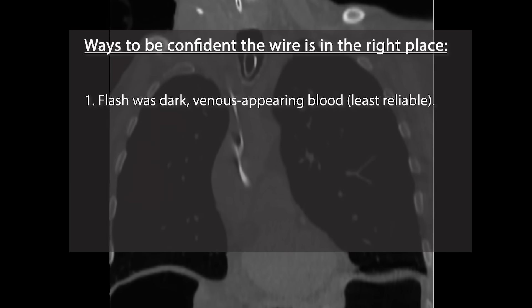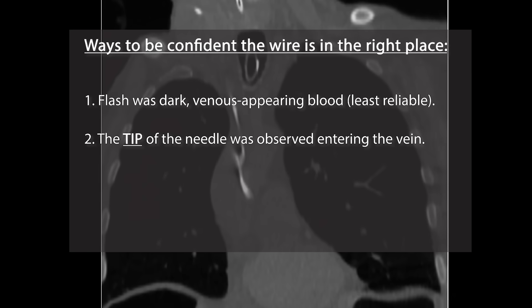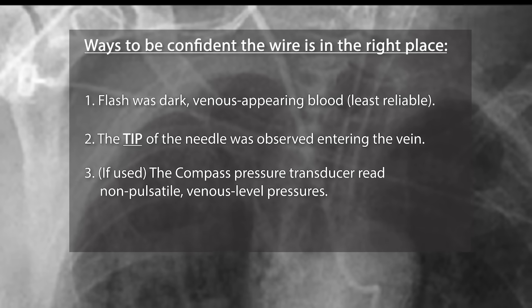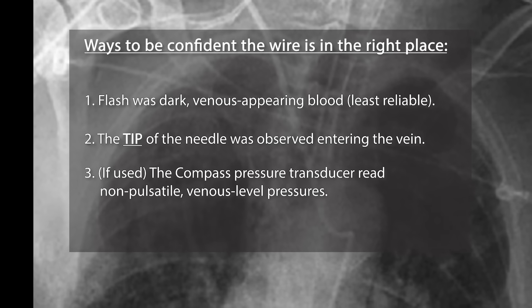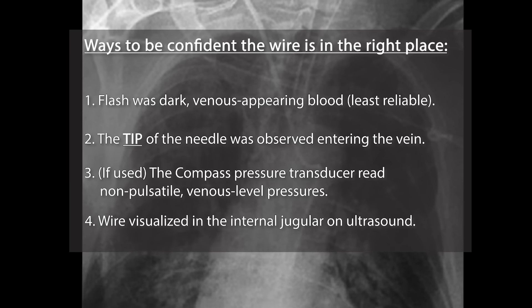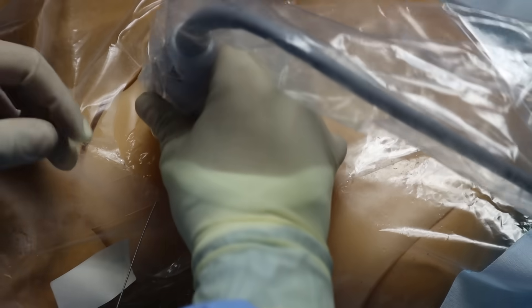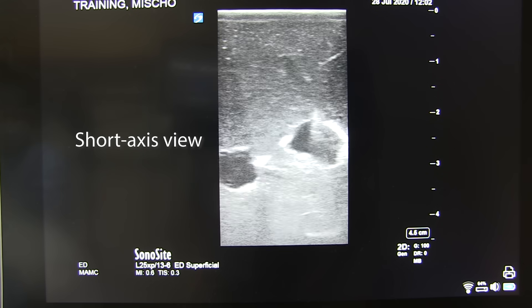Here is how I am confident that I put the wire in the right spot. One: the initial flash was dark, venous-appearing blood. Two: under ultrasound, I saw the tip of the needle entering the vein and not the artery. Three: the compass pressure transducer, if I'm using it, was reading a non-pulsatile, venous-level pressure. Four: I see the wire traveling down the jugular on ultrasound. Pick up the ultrasound and put it just over the wire. In short axis view, follow the wire down the jugular as it meets the subclavian. Then do the same thing in long axis view.